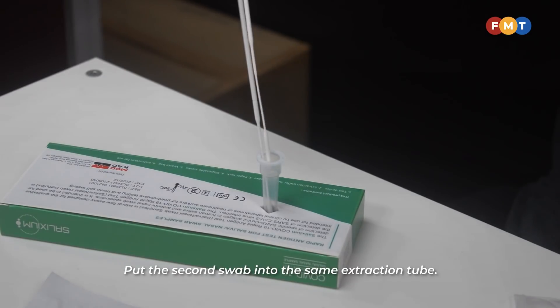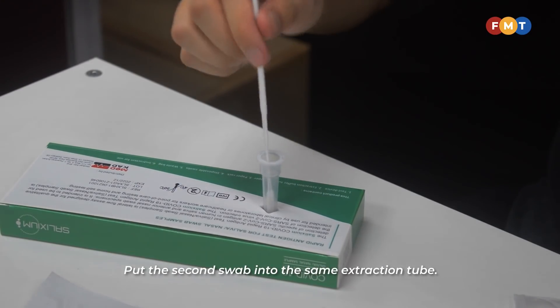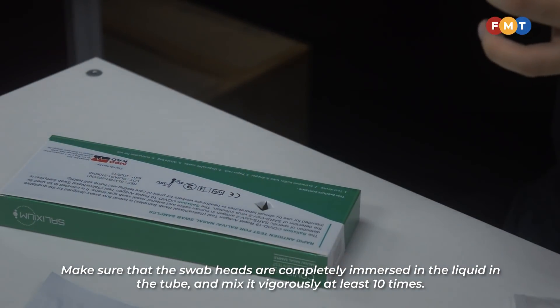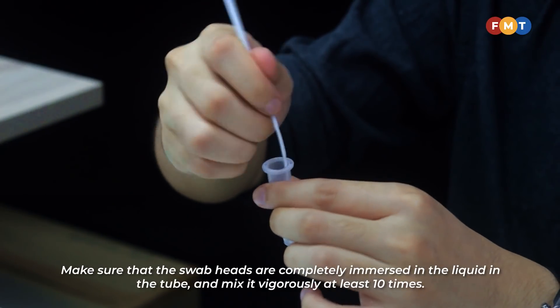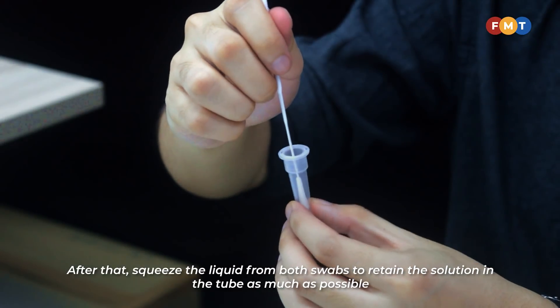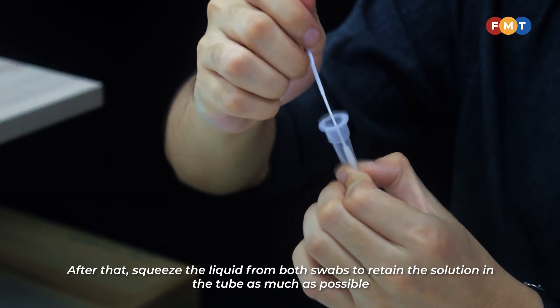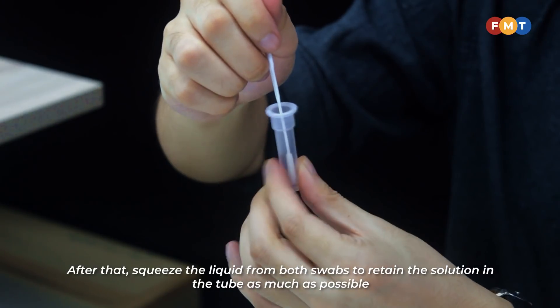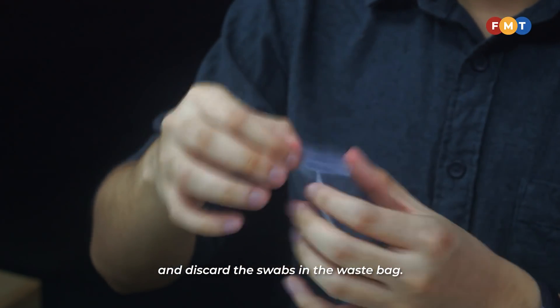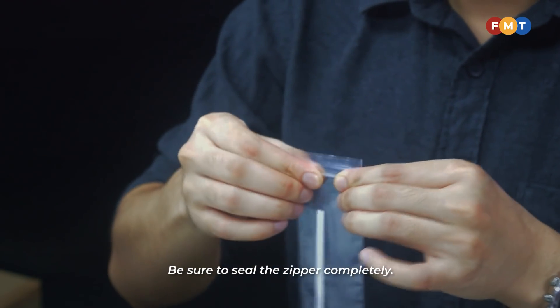Put the second swab into the same extraction tube. Make sure that the swab heads are completely immersed in the liquid and mix it vigorously at least 10 times. After that, squeeze the liquid from both swabs to retain the solution in the tube as much as possible, and discard the swabs in the waste bag. Be sure to seal the zipper completely.